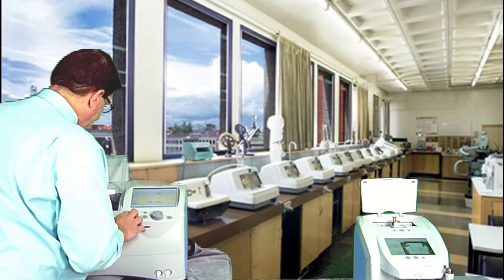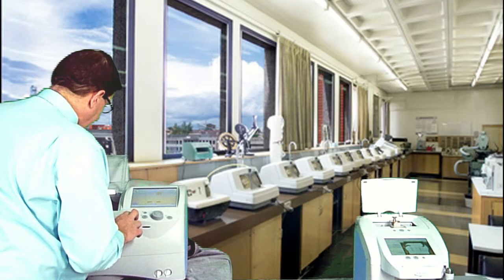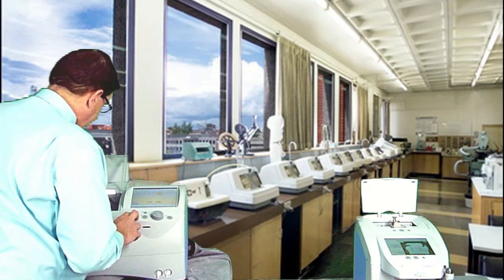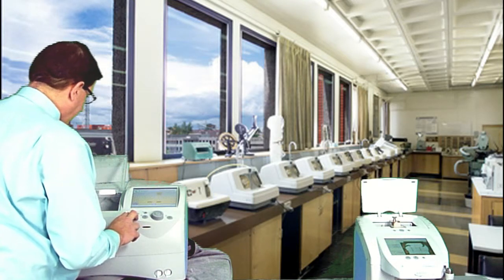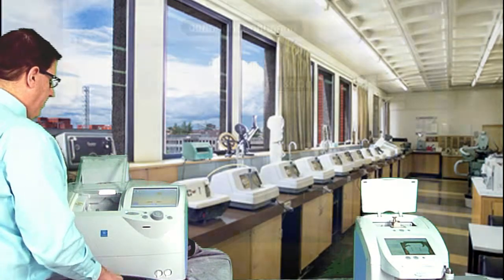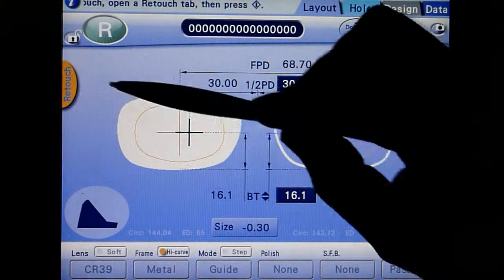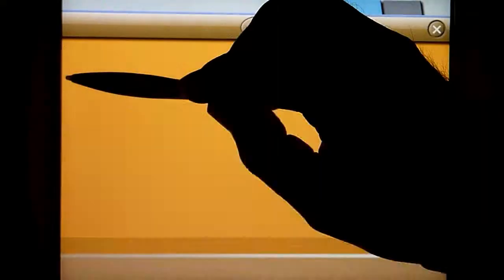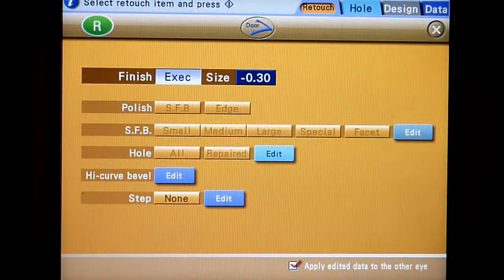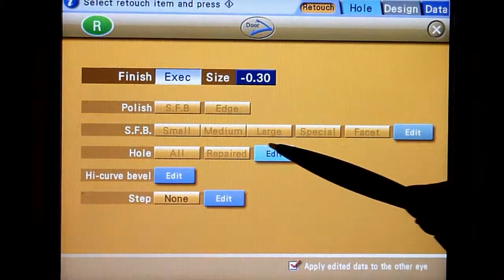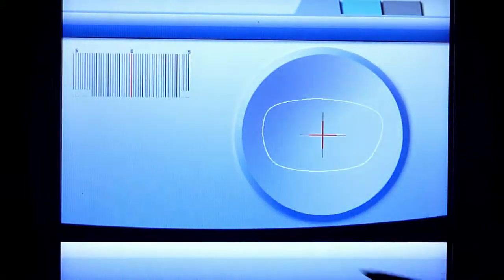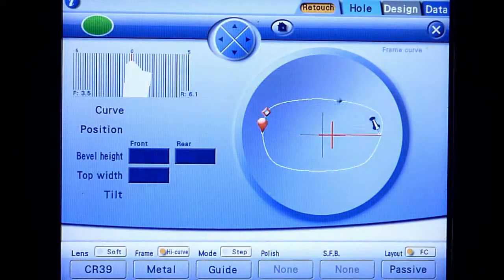If the lens requires further adjustment, use the retouch function. Touch the retouch tab. Next to high curve bevel, touch edit to open the high curve bevel simulation screen.